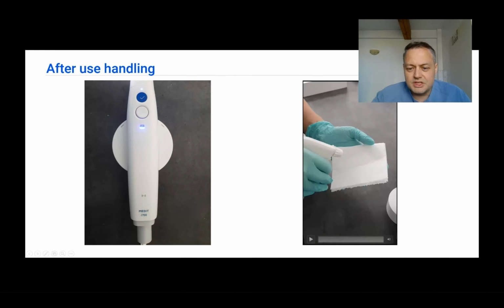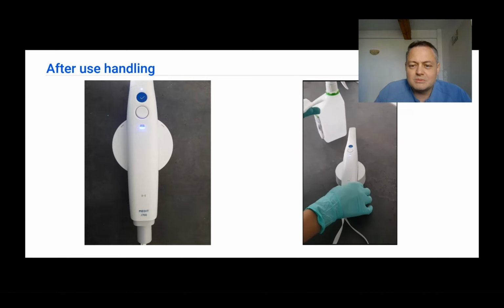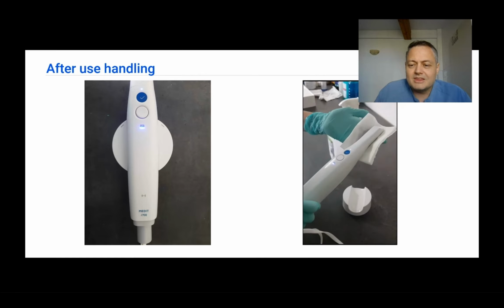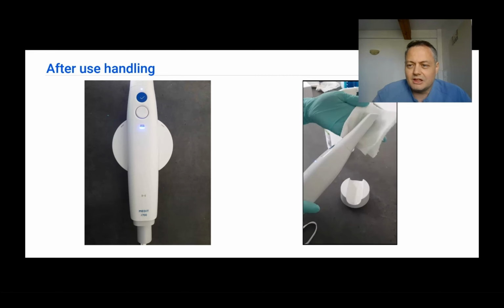Also, as you can see on the right, the process of disinfecting the scanner by itself is done by spraying sterilization agent on a dry cloth and wiping the scanner off, but never ever use sterilizing agent sprayed directly on the scanner, because it can get inside and it can damage your device. So always spray the sterilizing agent on a cloth or on a piece of paper, and just then wipe the scanner off.